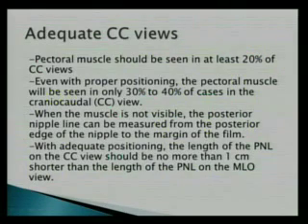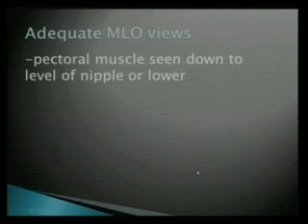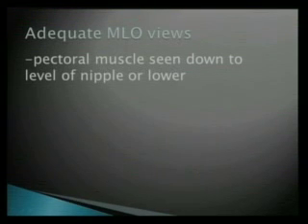And again, this is actually a question that I've seen recently. They wanted to know about the length of the posterior nipple line on the CC view. It should not be more than 1 centimeter shorter than the length of the same line on the MLO view. Let's talk about the MLO view, and then I'll show you the image so you can see where that posterior nipple line is, just so you have a picture.